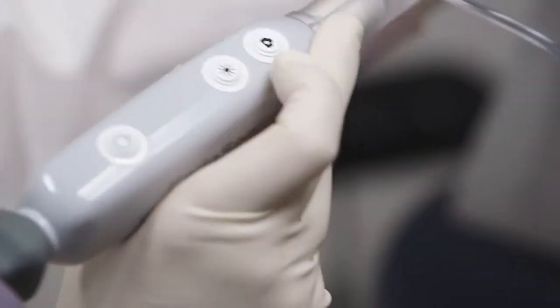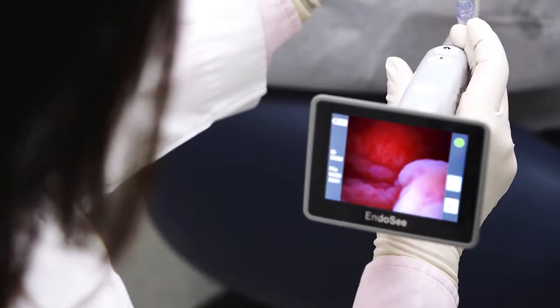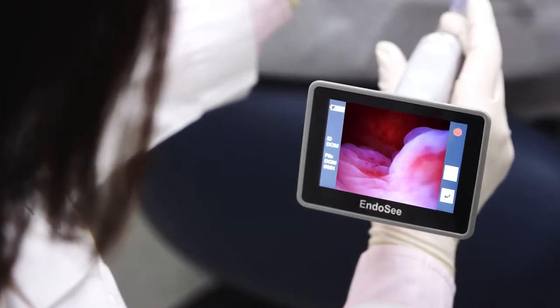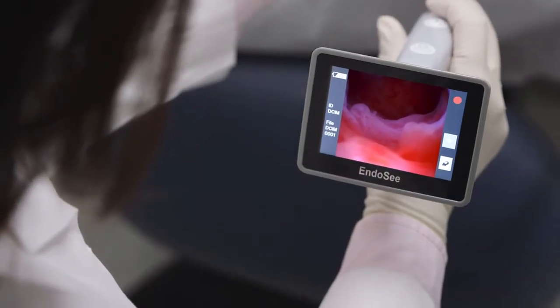To capture still photos during the procedure, simply press the camera button once. For video, press and hold the camera button until the green dot in the upper right-hand corner of the display changes to a red blinking dot. To stop recording, press the camera button one more time.